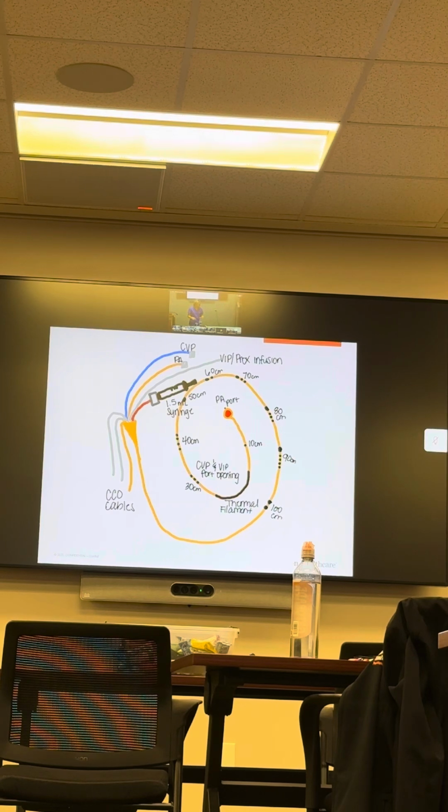Okay? You also have here the white lumen. This is your VIP. It's also called, if you read on there, your proximal infusion port. All right? So keep your very important drips here. It is my preference that we put a manifold with a carrier always. If they didn't come with any drips, they came to the ICU, don't worry, they'll probably buy 1 or 2. Let's just be ready. And only having your inotropes and pressors on here is what is going to keep them safe. Okay? So a carrier and just your very important drips.